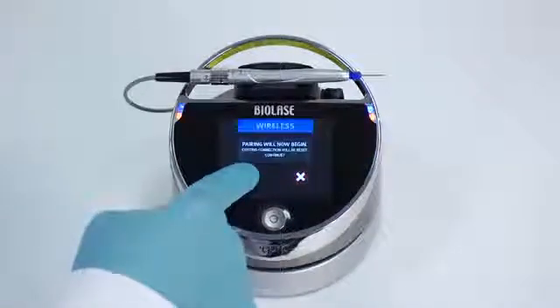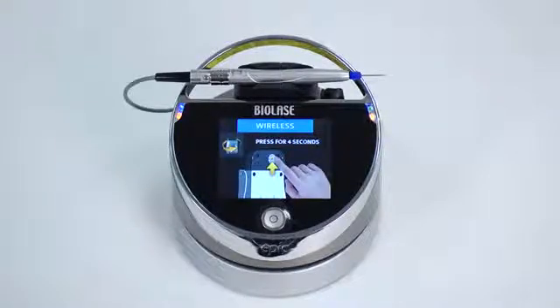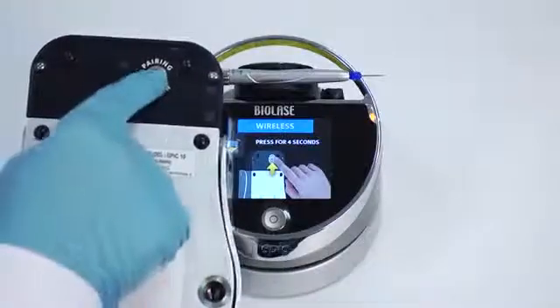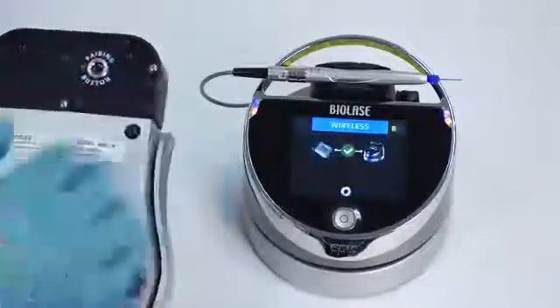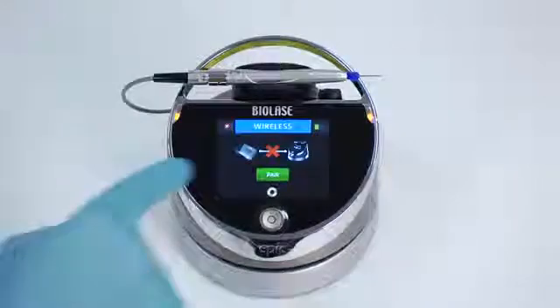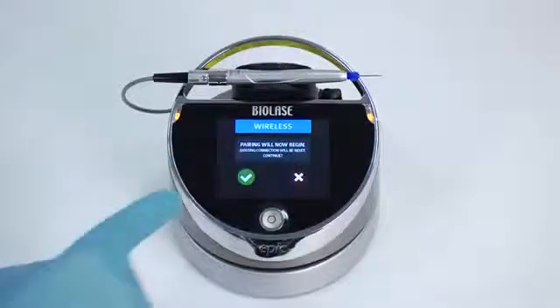Press the green check mark to continue. To complete the pairing process, turn the foot switch over and press the pairing button for four seconds, then release. After two to three seconds, a message should appear indicating that pairing was successful. If pairing is not successful, a screen will appear with a red X between the EPIC and foot switch. Press the try again button.